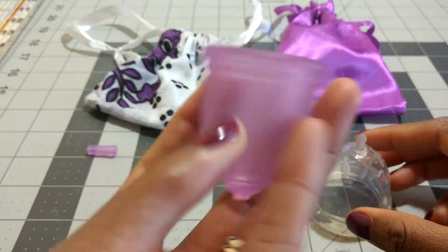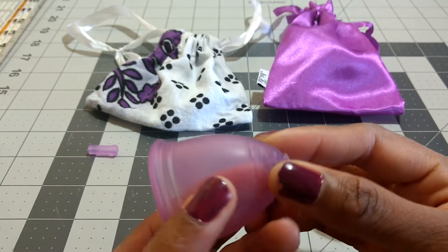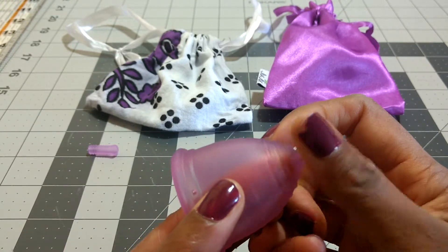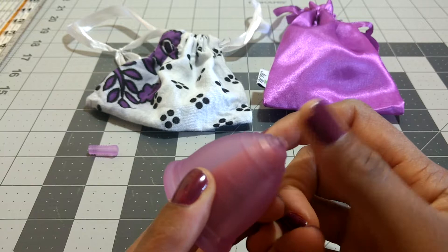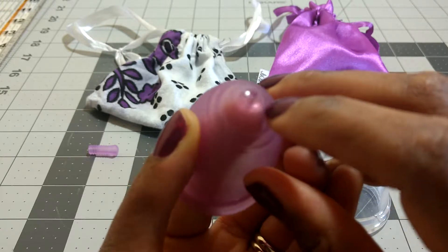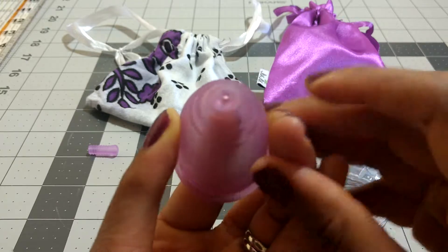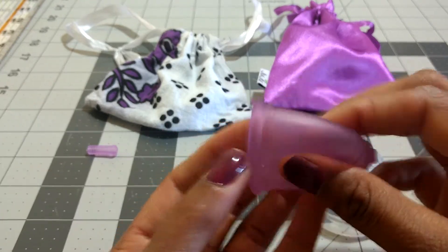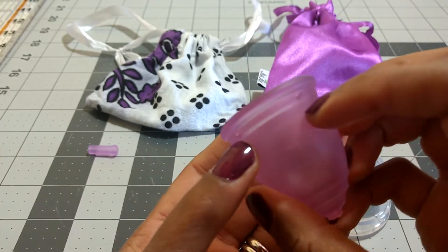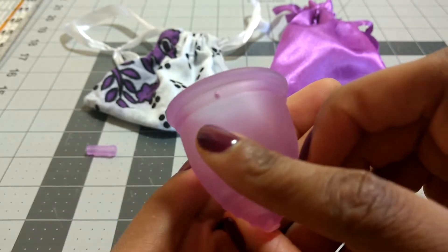With the Ruby Cup, the grip rings here are not the grippiest, but I actually prefer that because I don't need grip rings — they have a very smooth transition, so it's not too rigid and you don't really feel it at all. There's a little hole where the stem was; I haven't had any trouble cleaning that, but it's something to keep in mind. This is an overall soft cup. It does have four suction release holes as well, but these are very small and I personally think it's hard to clean without running water.